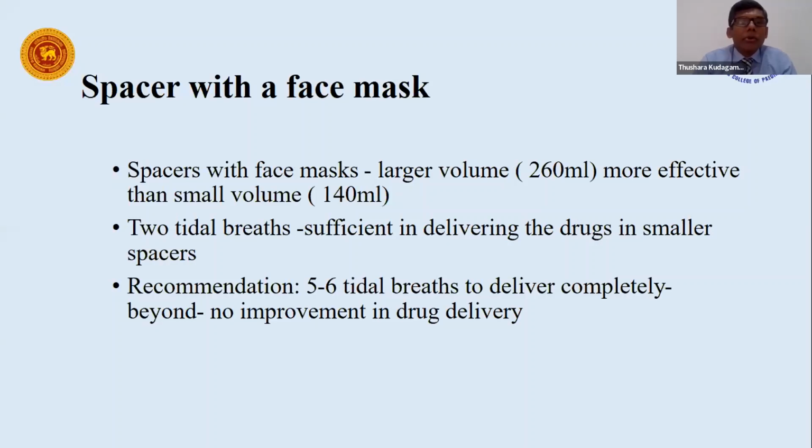Then when you use a spacer with a face mask, these are generally smaller devices, mainly used for smaller children. You have relatively larger volume ones up to 260 ml, and small ones up to 140 ml. When you use a spacer with a face mask, you generally use tidal breaths, because these small children are unable to take slow deep breaths.